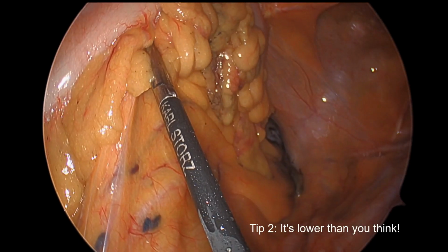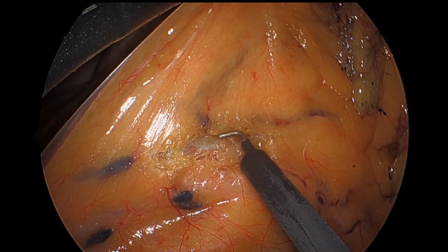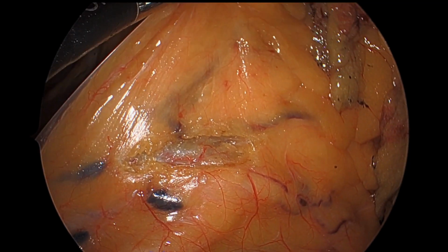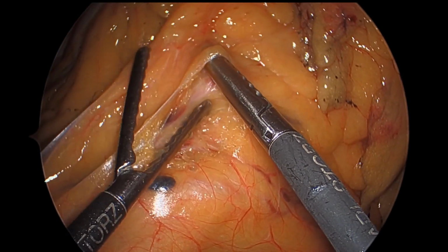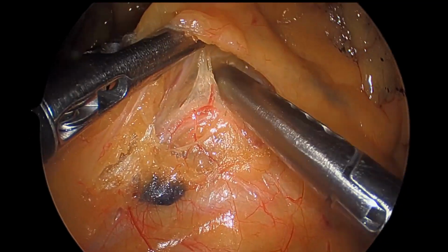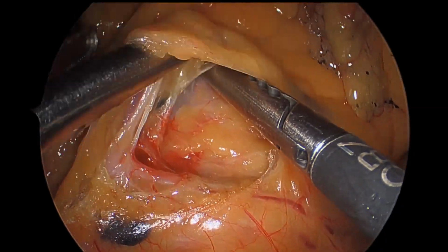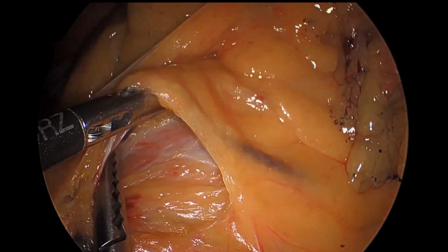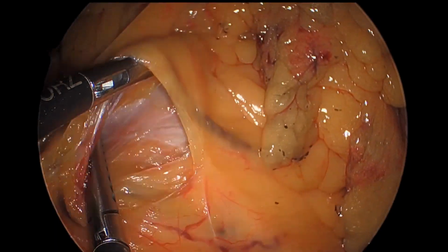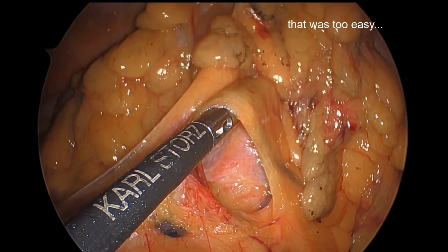So again, it's lower than you think when you're starting the dissection, but we're worried that we're going to get under the retroperitoneal structures, which is a reasonable thing to be worried about. Here we're actually starting our dissection under the left colic, although we think it's the IMA. You can convince yourself here that you're dissecting the right plane. It almost sort of looks like an avascular plane. It almost looks like there's the retroperitoneum that you're sweeping away. But it's too thin. And it's too easy to get into the right spot and get into the sidewall. Yeah, like the caption says, it was too easy.